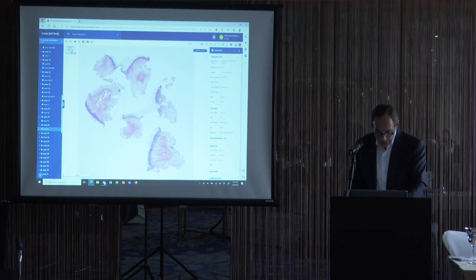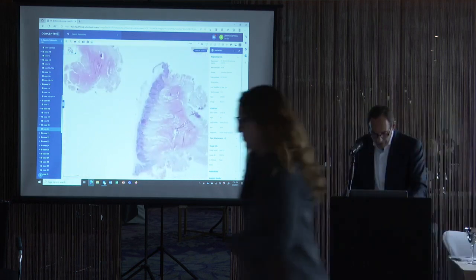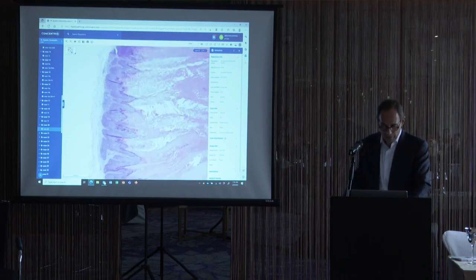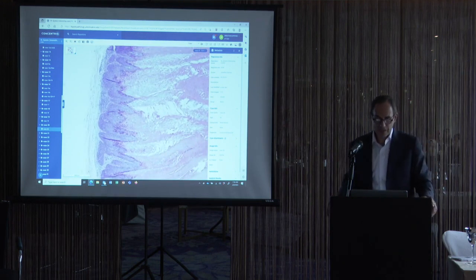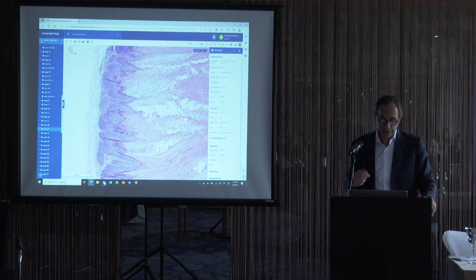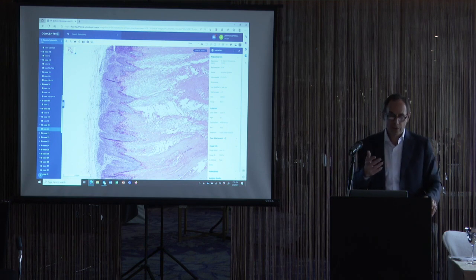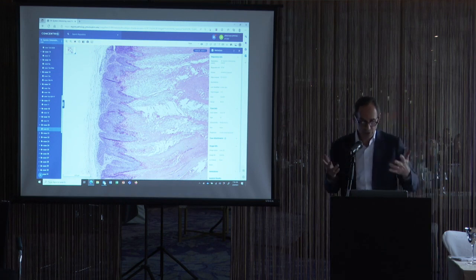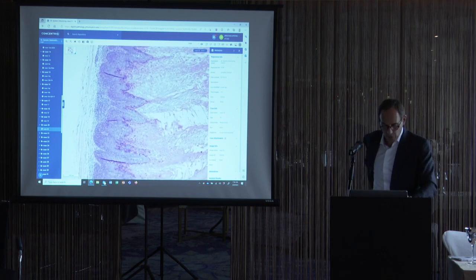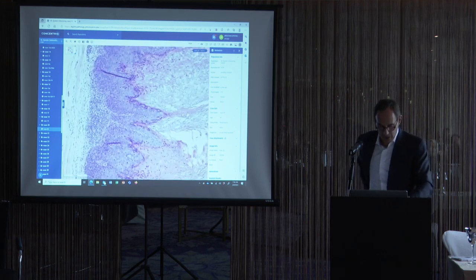This is a penile lesion. With penile squamous lesions, there are several different types of invasive squamous cancers of the penis. There's usual squamous cancer, which is about 50%. There's a warty basaloid squamous cancer, a warty squamous cancer, a basaloid cancer that we'll talk about, and verrucous carcinoma. But this is an example of a basaloid warty carcinoma that's non-invasive.